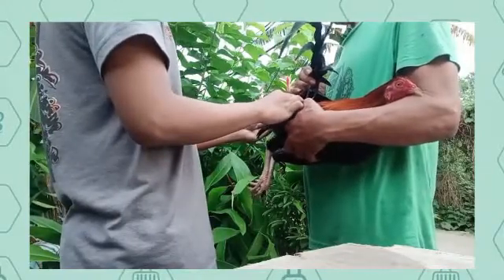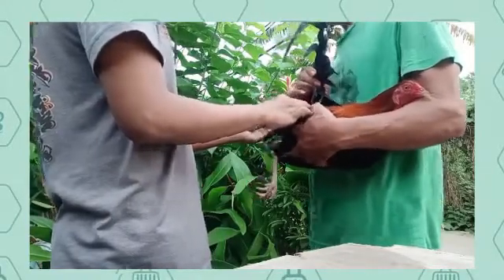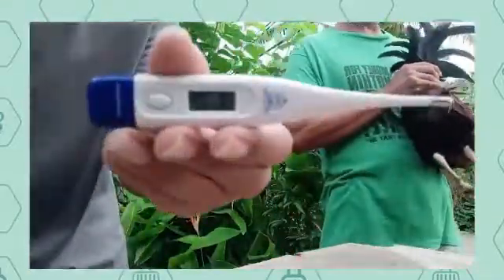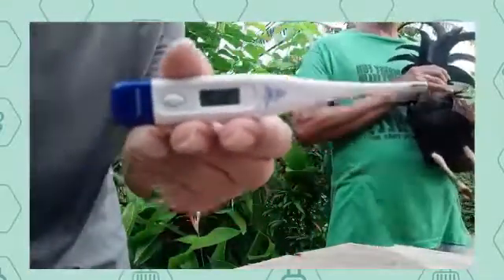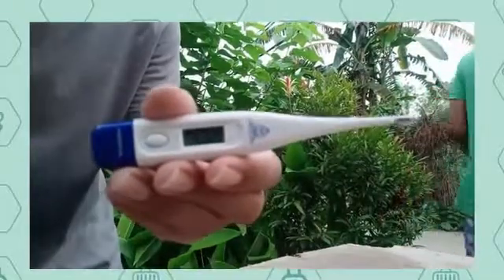Once it reaches the temperature result, we can easily remove the thermometer and clean it with dry cotton. Lastly, don't forget to record the temperature as observed.